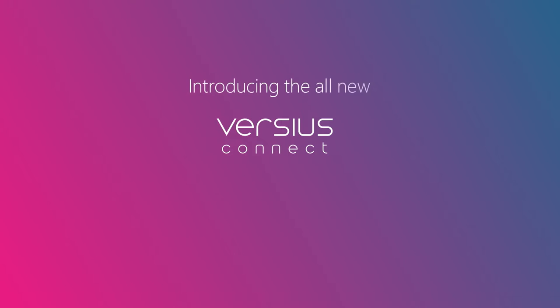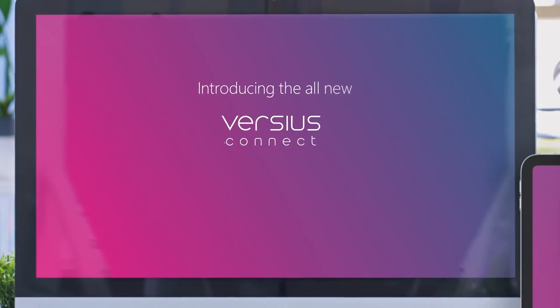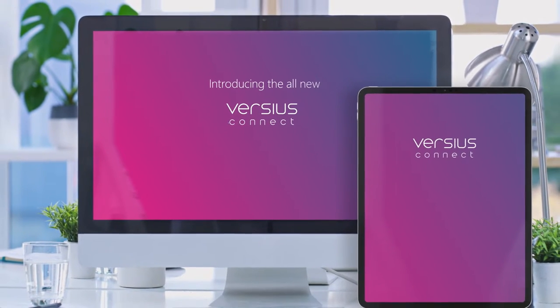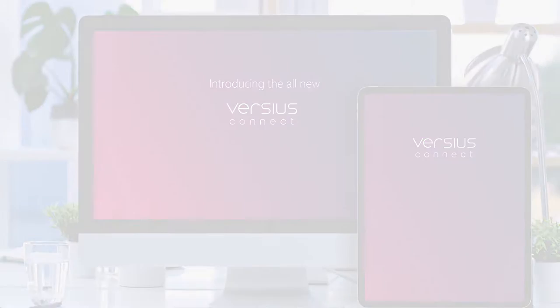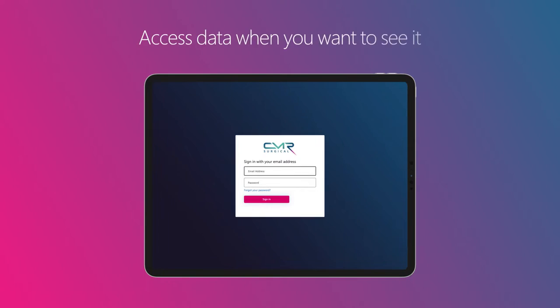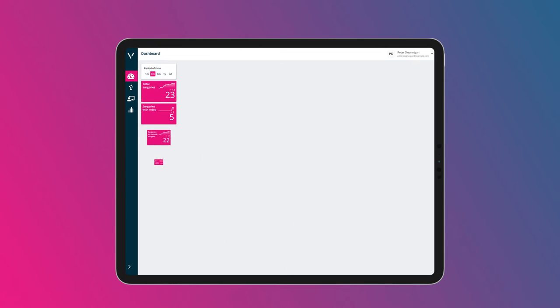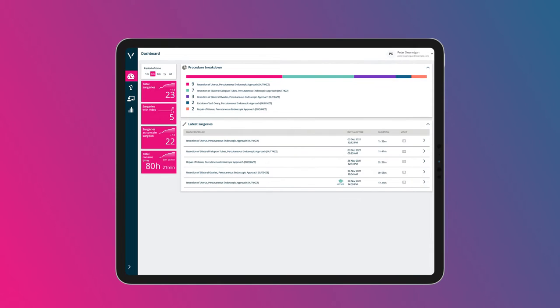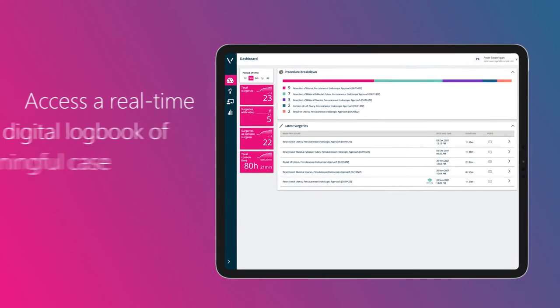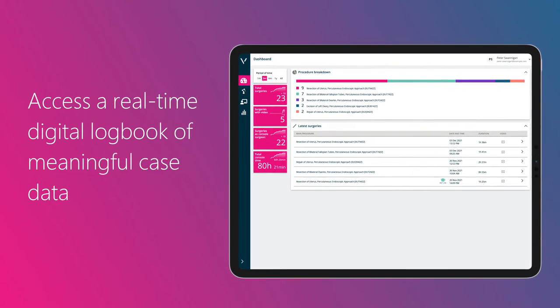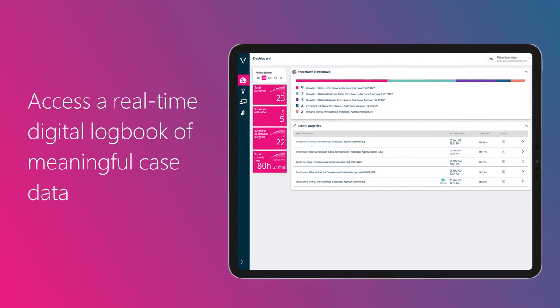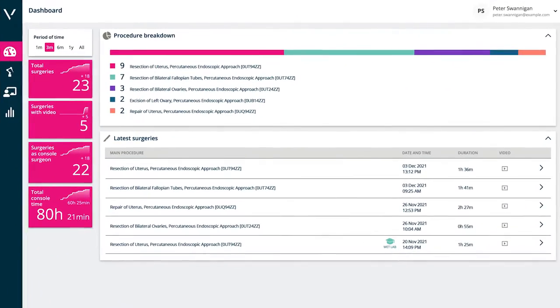Introducing the all-new Versius Connect. Versius Connect allows you to access the data you want to see, when you want to see it. With a single integrated experience, giving you access to a real-time digital logbook of meaningful case data, all in one place.